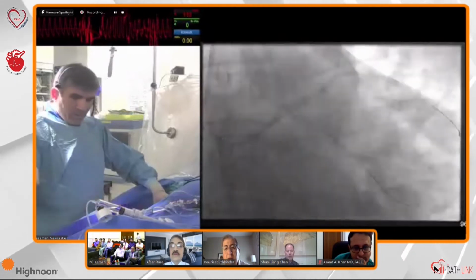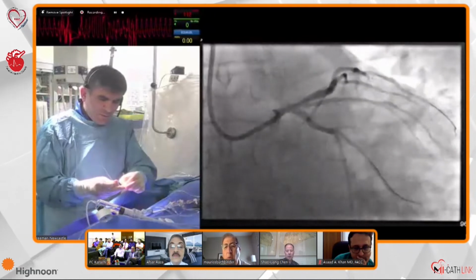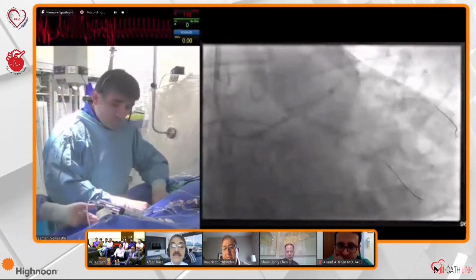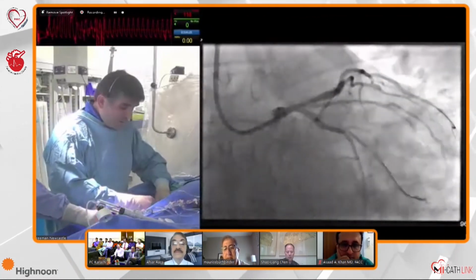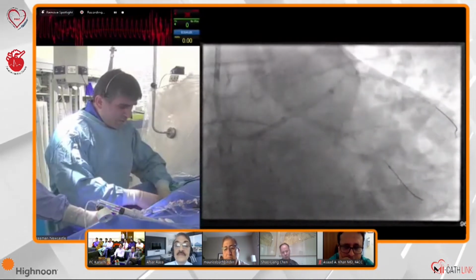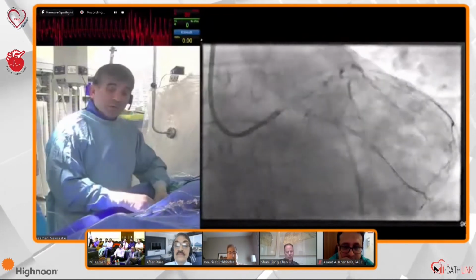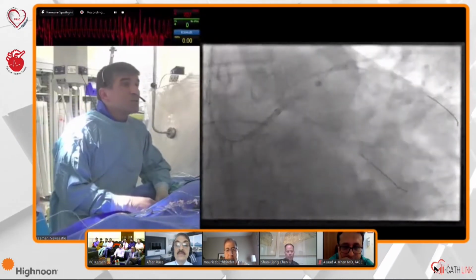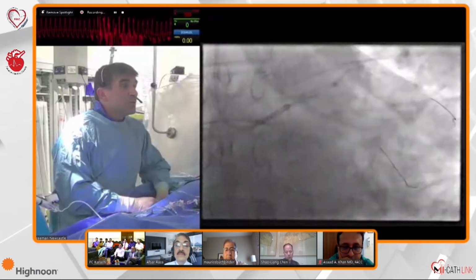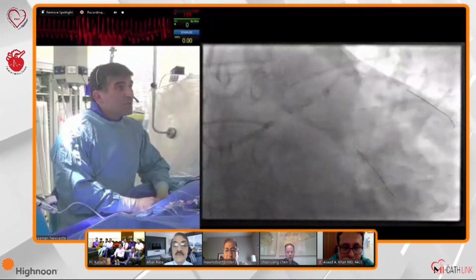One question. And that's why you did not worry about the OM1. Leave it be. Yeah, I think I'm going to leave it be, to be honest. The IVUS reassured me. And this is one thing about the point that Nadeem said at the beginning: if I'm going to use the IVUS, I might as well get the information even before, because it will impact how I approach the lesion and the case. Everybody was thinking the intermediate was going to be a problem, but luckily it's not.